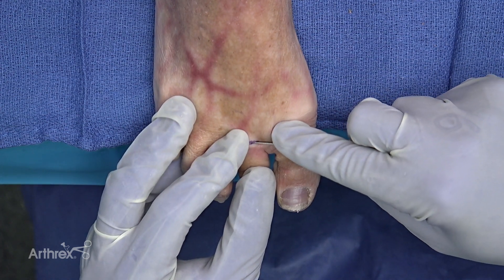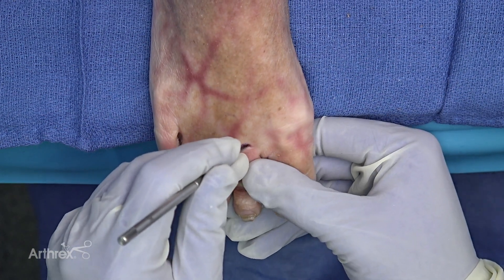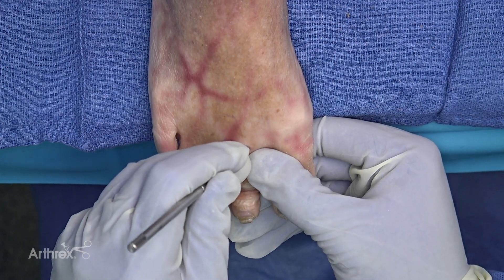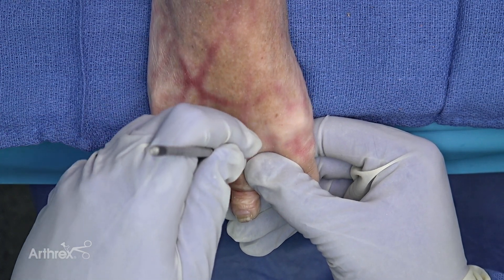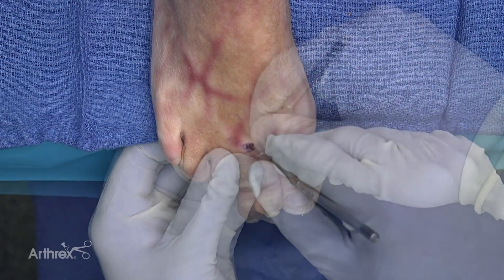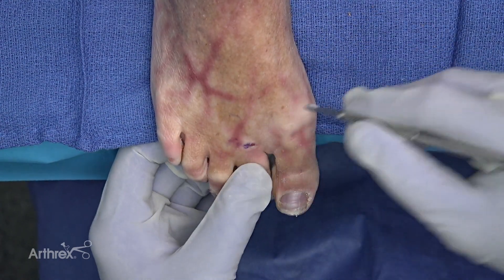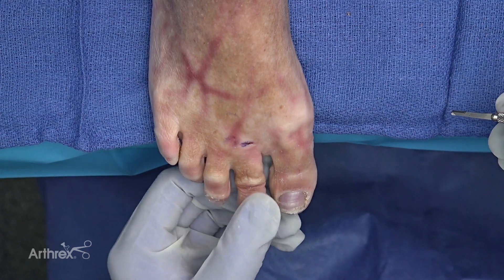In addition to the tendon release, sometimes you have to release the collateral ligaments off the base of the proximal phalanx. That can be done through the same incision by gently turning your blade distally, with care taken to prevent injury to the adjacent neurovascular bundle, and continuing sequential releases until you have adequate release of the dorsiflexion contracture at the MP joint.